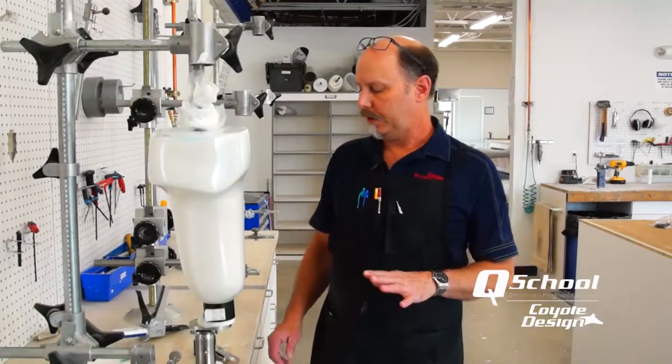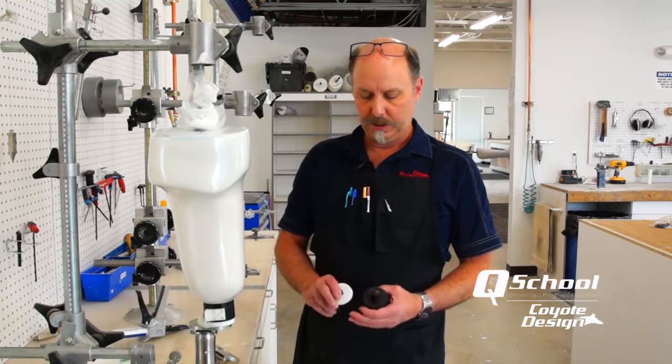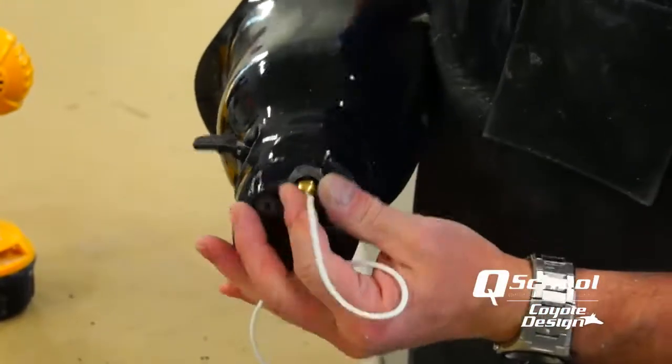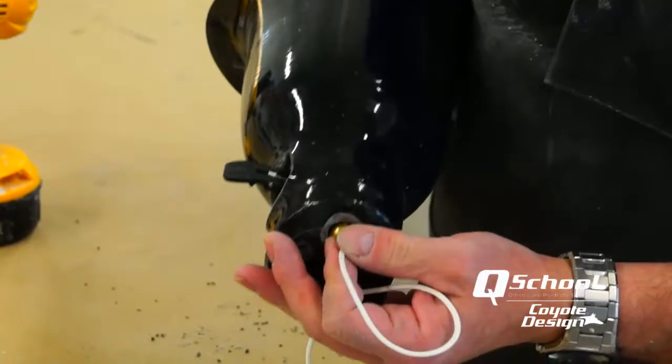Today we're shooting a video on how to use one of our deep locks and turn it into a lanyard system, where you take the deep lock, open the end of the lock up, and have a cord that runs through your pin and through the lock. You're able to take an AK and make a lanyard pull out of the AK.